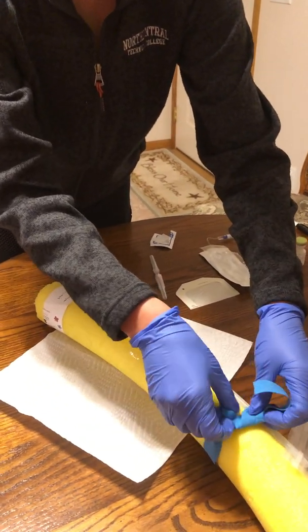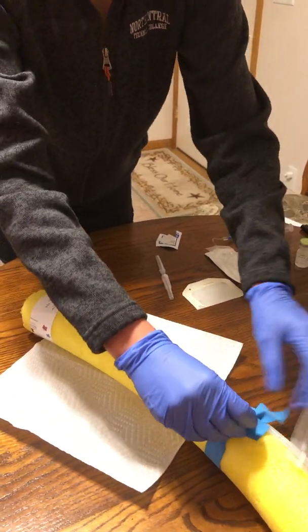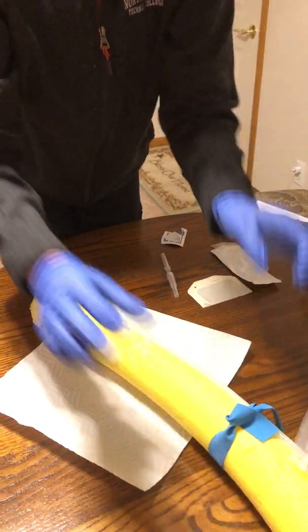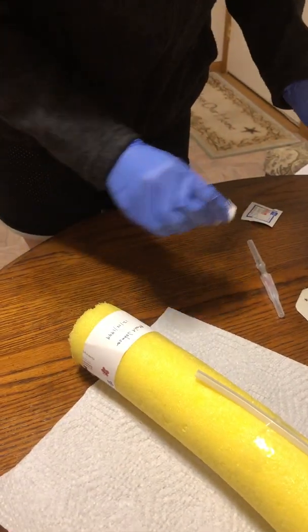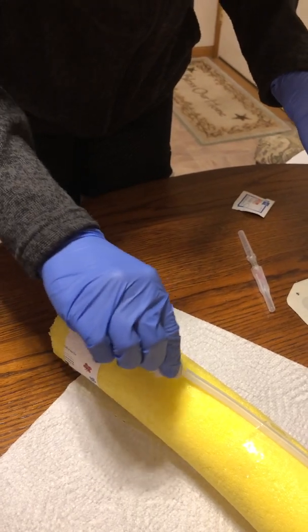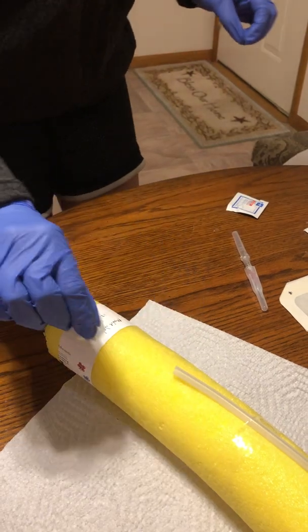Make sure I can feel a pulse. And I can feel a pulse. So now I'm going to do circular motion inside to outside, and then I will allow that to dry.